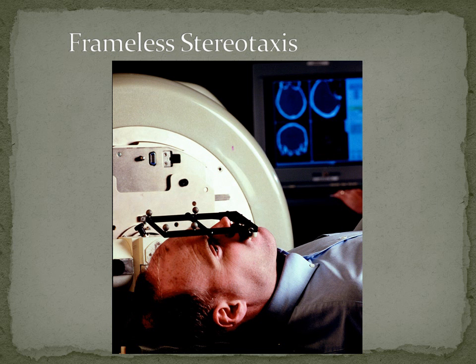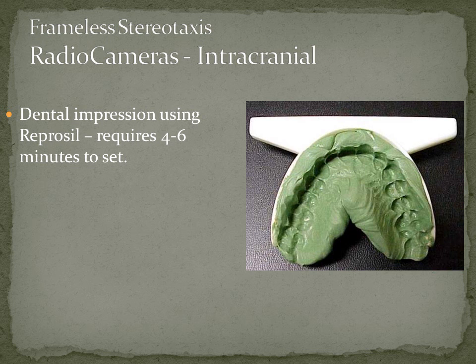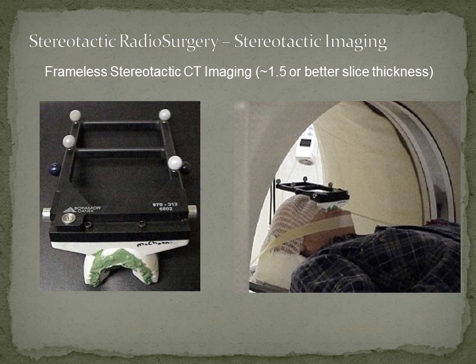When we actually went to the optical system, we did lose a certain amount of rigidity, and so the question becomes, you can put a bite plate on the patient. How do you know the bite plate goes back in the same position? When you put a head ring on the patient, the head ring stays there and doesn't move. The bite plate can move. And so how do you know the patient's putting the bite plate back properly? We developed a system of being able to test these bite plates.